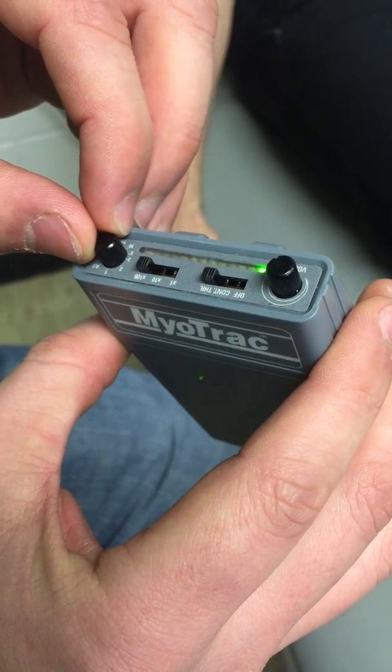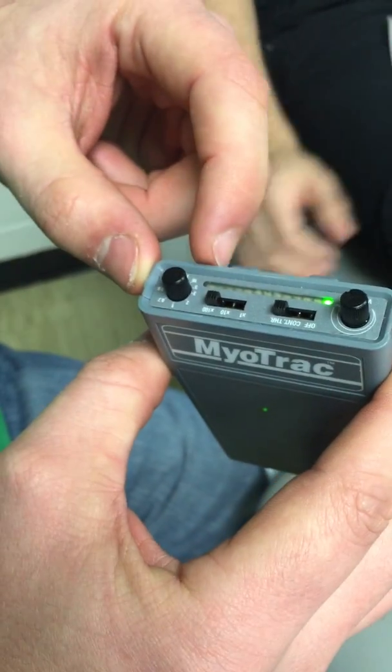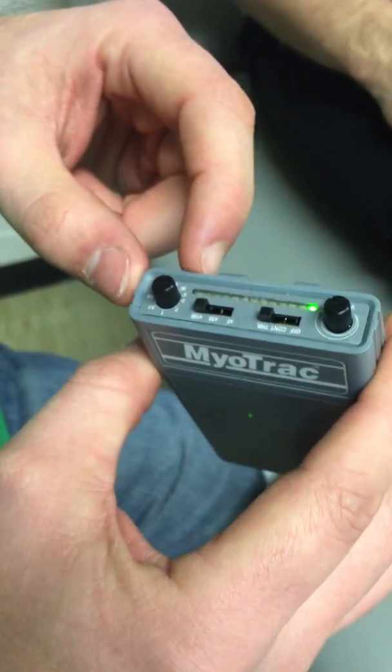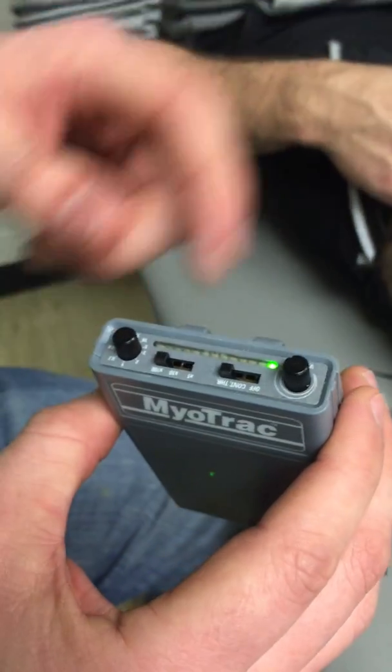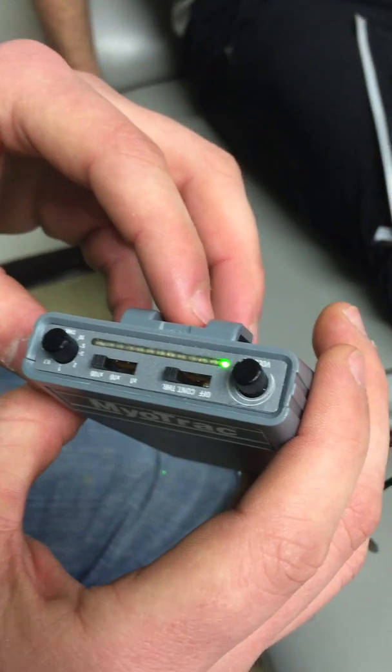What we've got set for Brett is 500 at the midline, because he's nearing about a thousand on his max contraction for his quad set. We're going to have him go ahead and do a quad set now — and we're getting nothing.